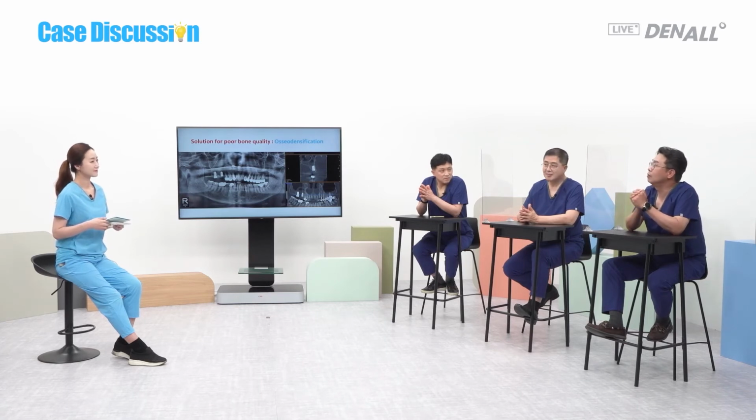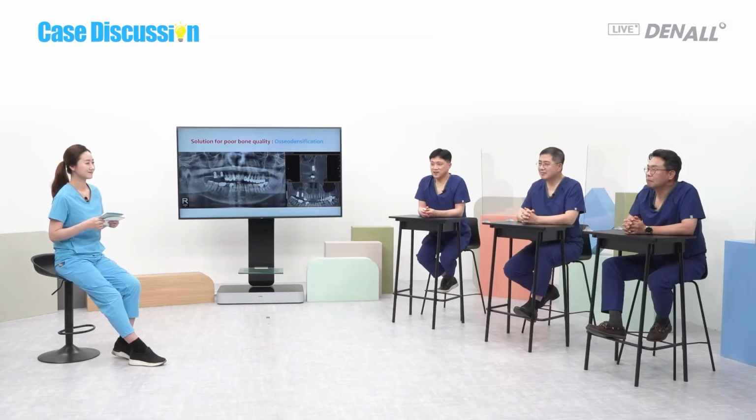If there's 1 or 2 millimeter cortical bone, I believe SS implant can work really well. In that case, as Dr. Kim Ki-Seong said, we can get initial stability sufficiently from there if we don't drop the implant into the maxillary sinus. If there is 0.5 or 1 millimeter cortical bone, we can get the stability from there. That was a very good point, and I totally agree with that.